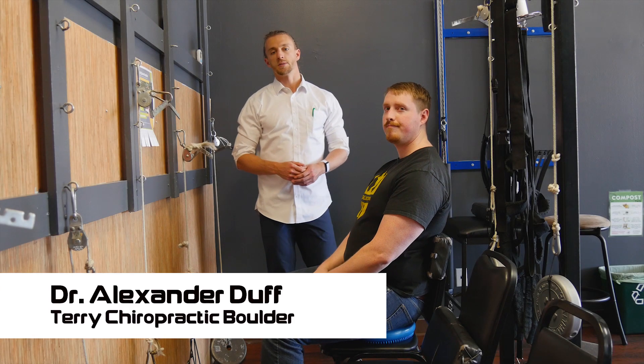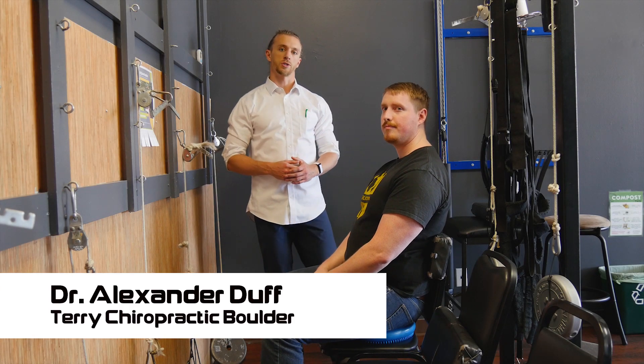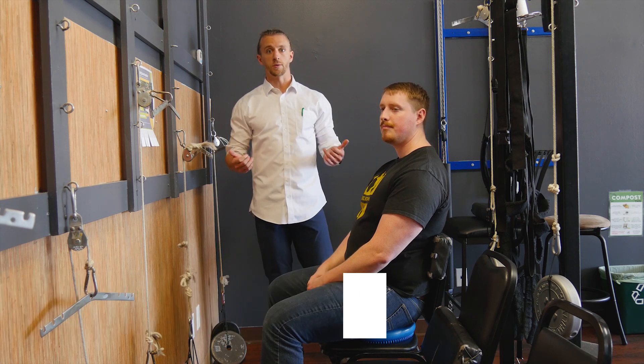Hey, this is Dr. Duff with Terry Chiropractic Boulder. Today we're going to talk about cervical traction, what the purpose is, and why we do what we do.